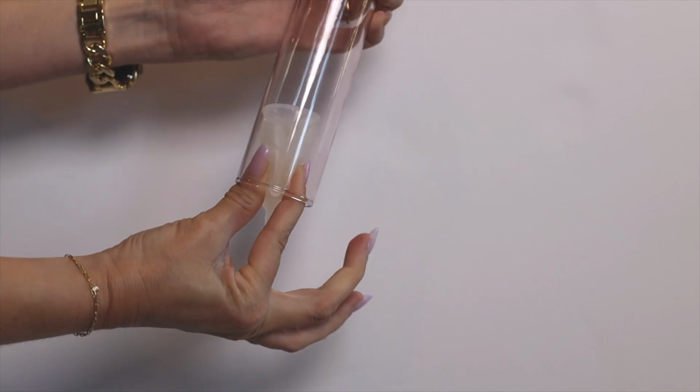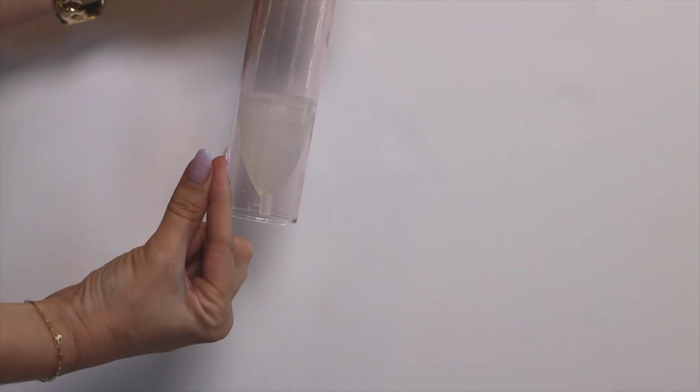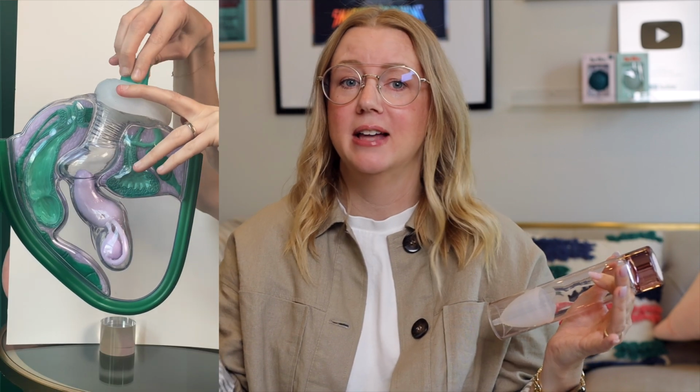Menstrual cups are also less involved to insert. And what I mean by that is when you insert a menstrual cup, once you've gotten the hang of things, you put your finger and your thumb in, and then you just walk the cup up. And so basically just the tips of your finger and thumb are what go inside your body. It's not like a whole hand in up to your elbow situation, which I think a lot of people have in their heads. It's not. Basically just these little fingertips and your thumb tip are what's going into your body to help you put it in.